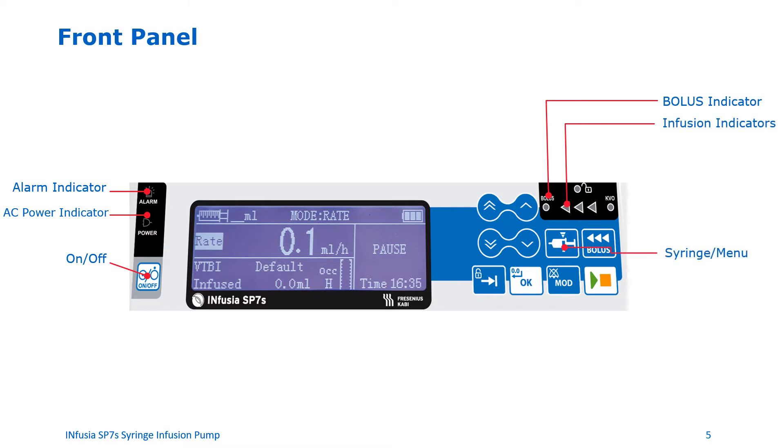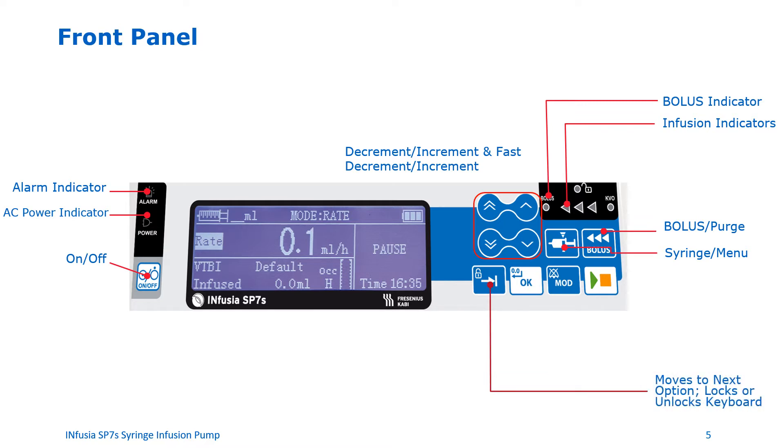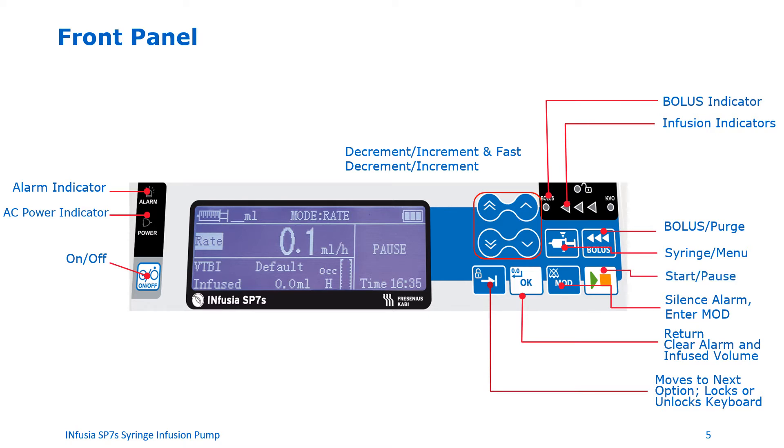The syringe button is used to recall the menu on the screen. The increment and decrement buttons are used to navigate the menu by moving up and down the screen. You can use the bolus purge button to deliver a bolus to the patient or purge the infusion set. The button with the arrow is called the switch button, which you can use to move to the next option, or lock or unlock the keyboard. The OK button is used to confirm a setting on the pump, acknowledge and clear the alarm, or as a return button to confirm the mode. The mode button that shows a bell with a cross through it is the silence alarm button, used to silence the alarm.